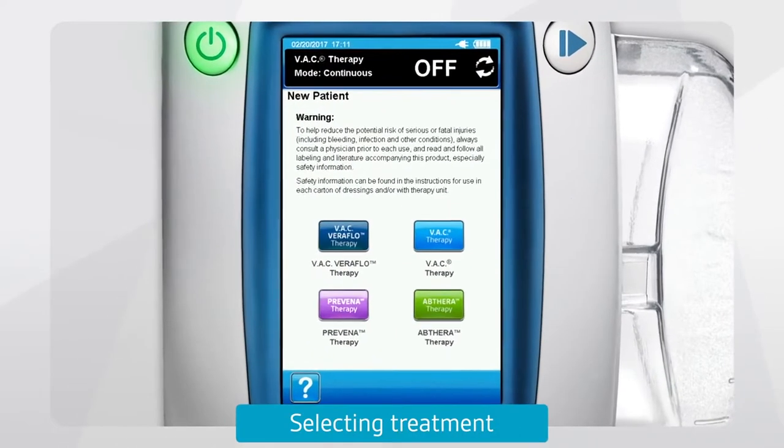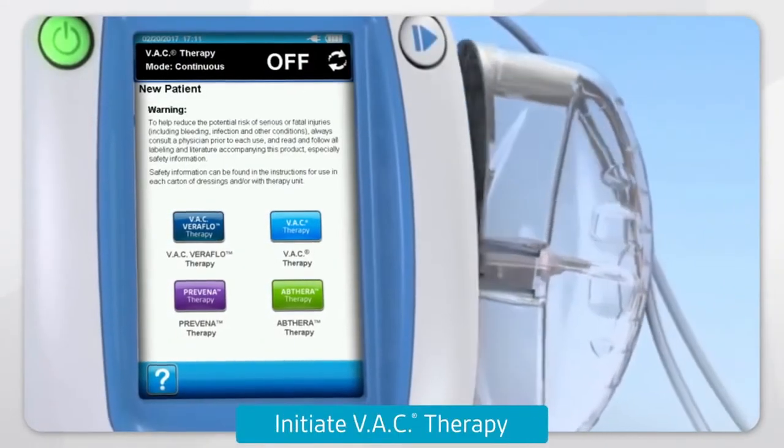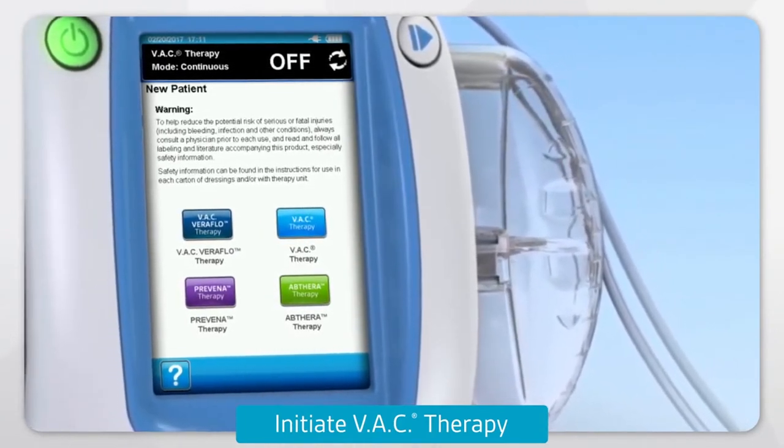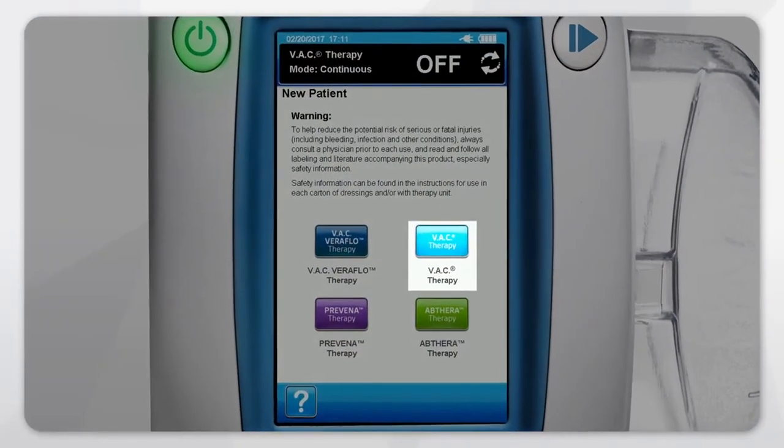To select a therapy, press the associated therapy button. To initiate VAC therapy, attach the VAC Alta canister — 500ml or 1000ml — to the VAC Alta 4 Therapy System. Press the light blue VAC therapy button.